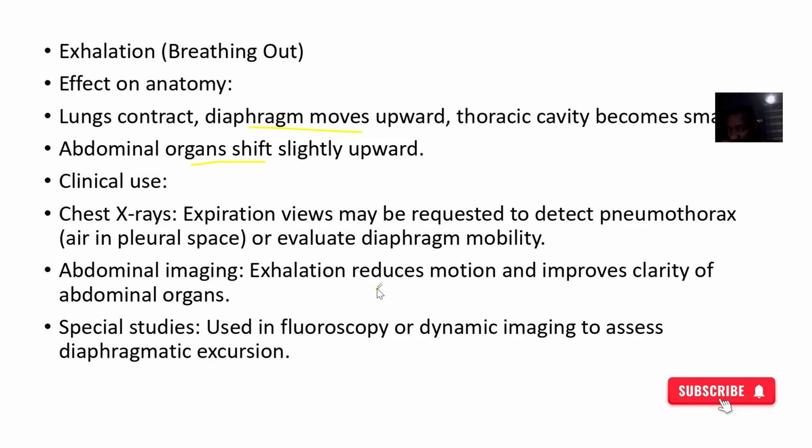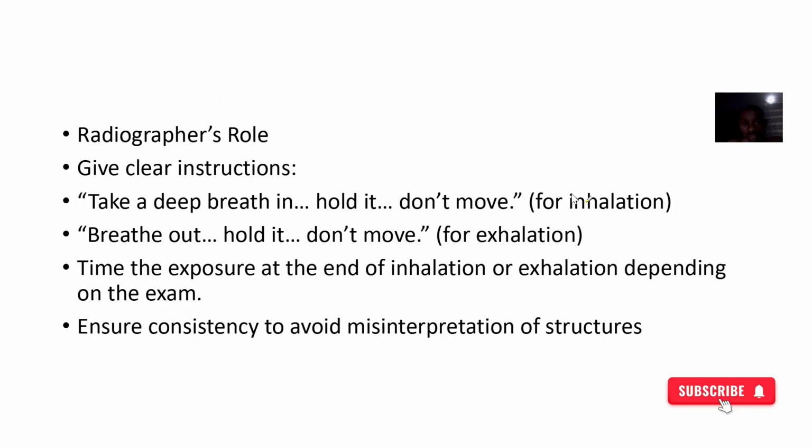Also special studies like fluoroscopy, which is basically dynamic imaging, where you follow up the imaging back to back in real time. So for the radiographer, you are supposed to give clear instructions to the patient, like taking in a deep breath and holding it, and you supervise and make sure that they're actually doing it as you instructed.